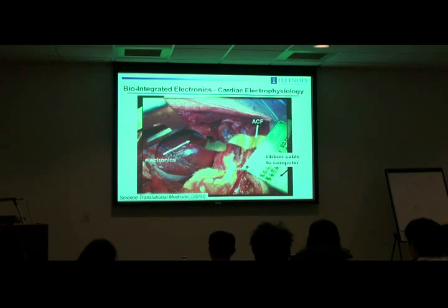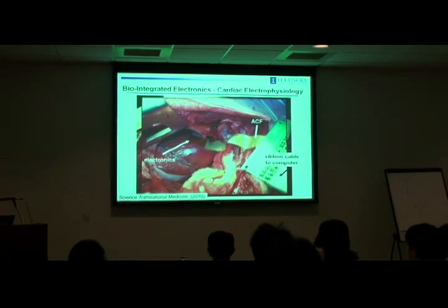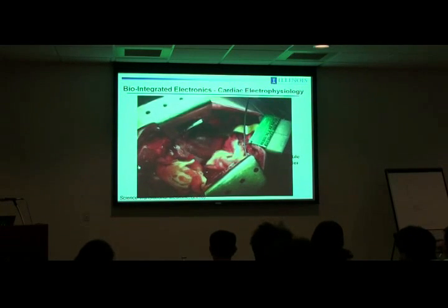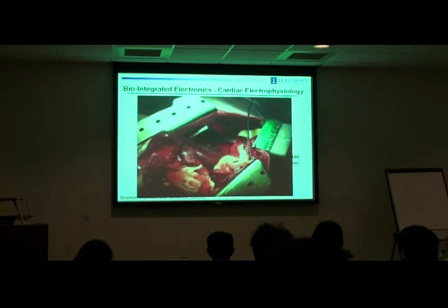So this is the device. And so instead of the penetrating pins that I mentioned before, that brain interface, these devices don't involve any adhesives or any penetrating electrodes because the device itself is so floppy, and the tissue is slightly wet. So you can almost imagine this being like a piece of saran wrap, a little thin plastic strip or sheet, that just sticks there. And so you just laminate it, a very non-destructive mode for doing the interface. Of course, this is high-density silicon electronics. And this is the ACF film, which comes out through a PCB board, and then there's a computer over here. So this thing mounts onto the heart as the diagnostic part of this cardiac ablation therapy, and then it can remain adhered as the heart is beating.